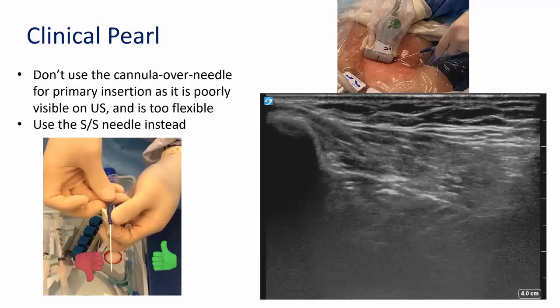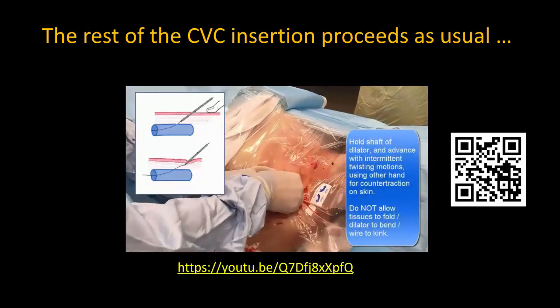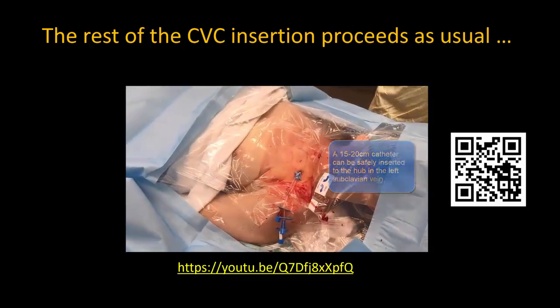I recommend using the steel needle instead. However, the cannula can be useful to secure the access you've obtained in the vein, particularly if you're having trouble advancing the guide wire. Josh Farkas from PulmCrit has a great tip: use the steel needle to puncture the vein, then withdraw the needle over the wire and exchange it for the cannula. With the cannula in place, you can fiddle with head and arm position without worrying about keeping the steel needle tip within the lumen of the vein. Successful passage of the guide wire into the superior vena cava and right side of the heart is usually confirmed by the elicitation of PVCs. From this point, proceed with the remaining steps of the procedure, which are identical to the landmark-guided subclavian cannulation technique and covered in more detail in my video describing that approach.